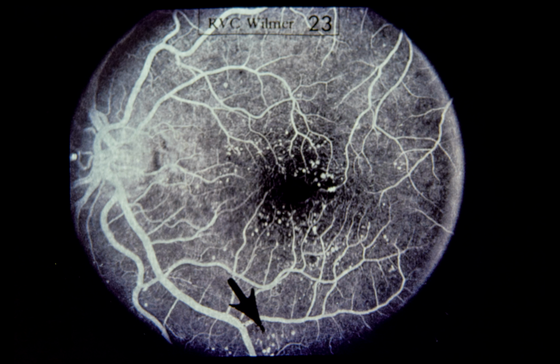When treating lesions this close to the center of the fovea, the smallest amount of energy necessary to achieve obliteration of the microaneurysms and other microvascular abnormalities is desired. It is important to note that it is not necessary to photocoagulate all visible microaneurysms and microvascular abnormalities, only those which cause dye leakage into the central macular region.